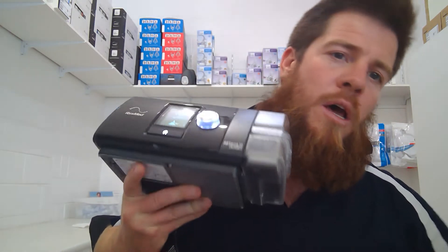Hi guys, just going to make a quick video about humidification within your CPAP machine. We're getting a few calls lately about how to change settings and whether or not you actually need to use your humidifier. Leading into the change of seasons, we'll often find issues pop up with the humidifier. I'll show you how to change settings on the AirSense 10, and also the options for the Air Mini.